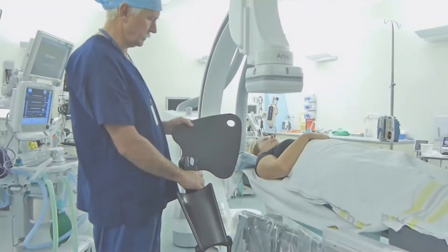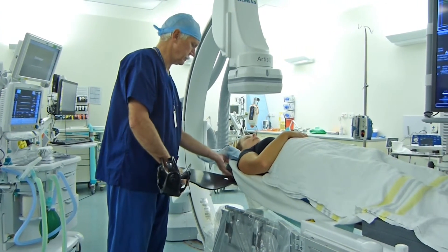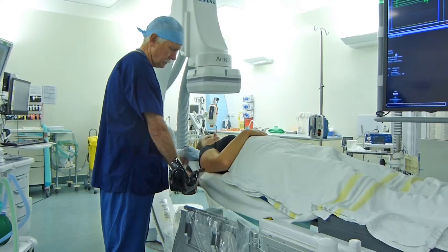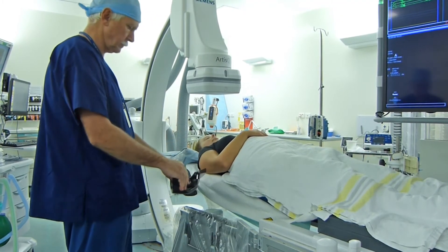This is the starboard. This is the portion that goes between the x-ray table and the mattress on top of the x-ray table. The starboard is aligned to the patient's shoulder. The patient can assist by rolling to their left side.